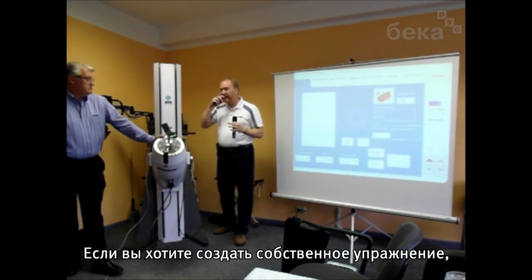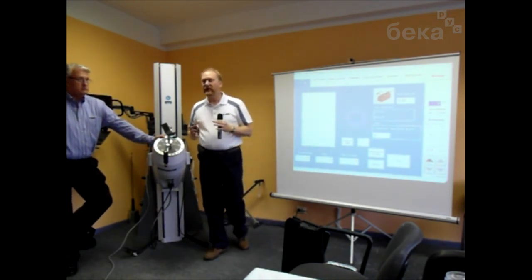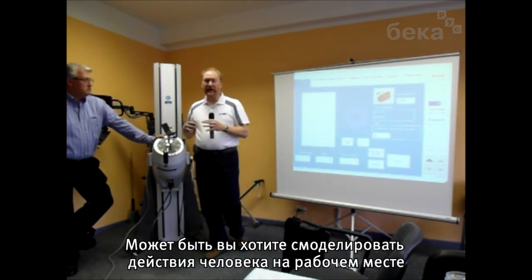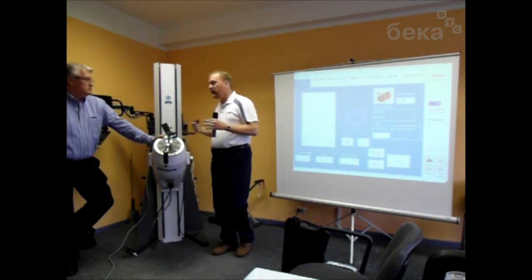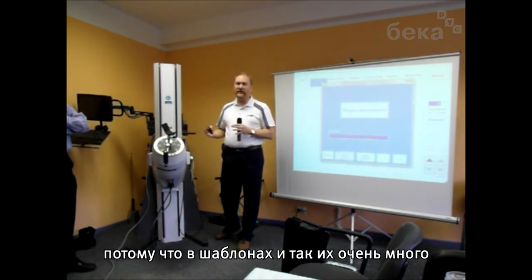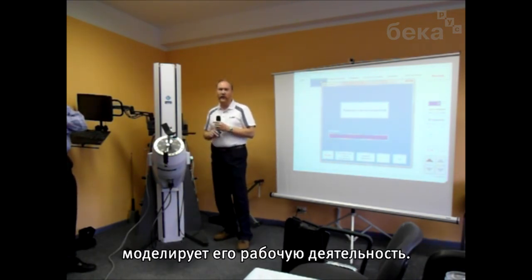If you want to create a custom exercise, as opposed to using one of our predefined templates, which focus really on isolated body areas, there may be instances where you're going to want to set up an integrated activity where you're doing a work simulation. Those exercises you would have to create because there's just too many of them for us to pre-create them in your software. You'll have to build the ones that are going to be appropriate for your patient population based on the kind of work activities they do.